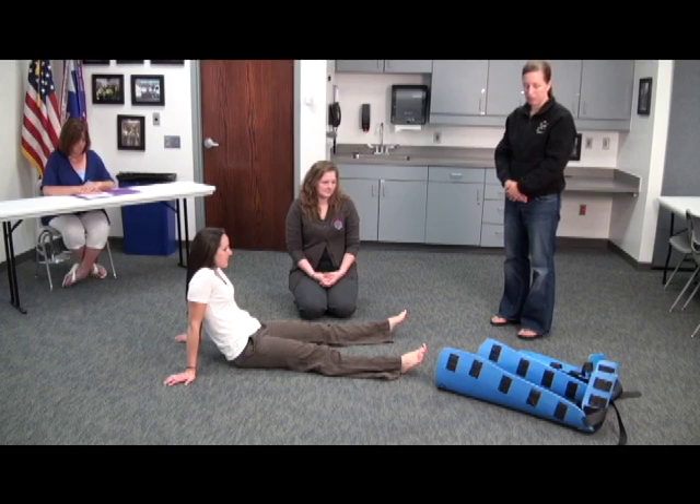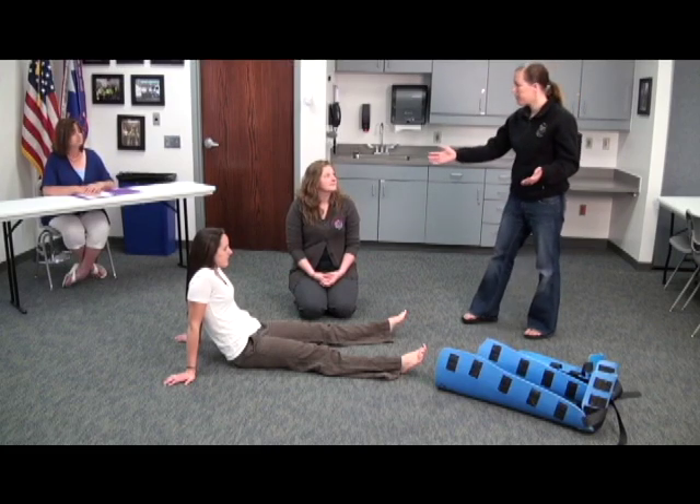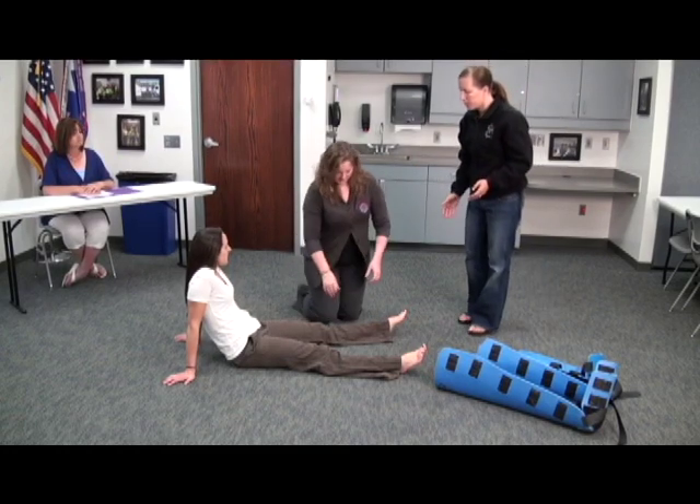You may use any equipment available in this room, and you have five minutes to complete the skill. Do you have any questions? I don't think so. Okay. BSI. Ma'am, can you hold manual stabilization of her injured tibia/fibula?